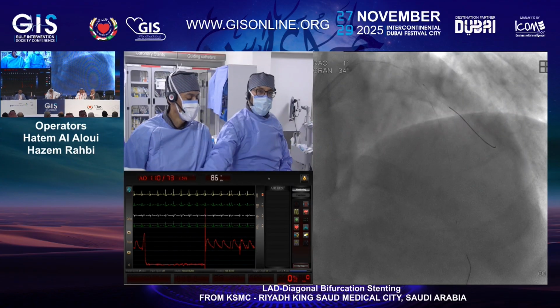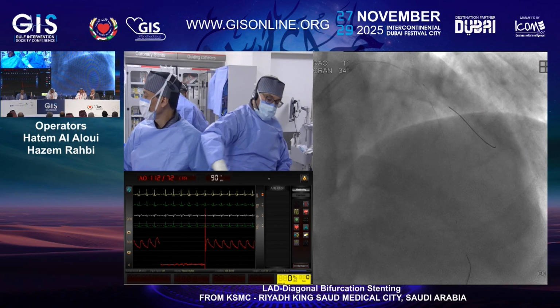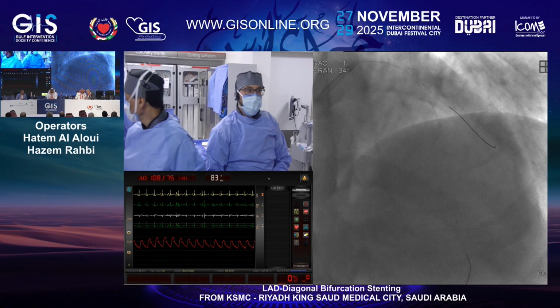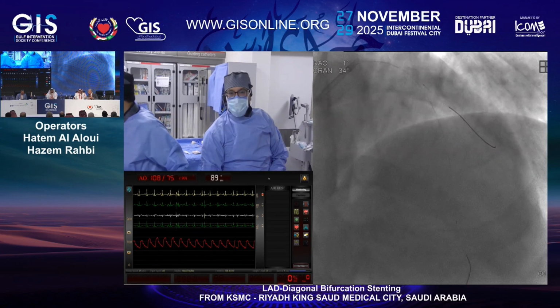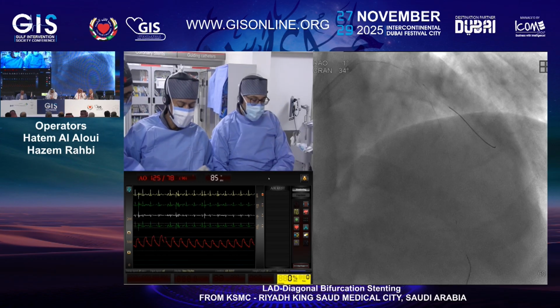Okay, I think we will cut as you have said. You want a 3.0 cutting? 3.5 probably, 3.5 cutting. Hatem, what was the balloon used now in the LAD? It was a 3.0 by 15 NC balloon, but as you have said, it's probably undersized.